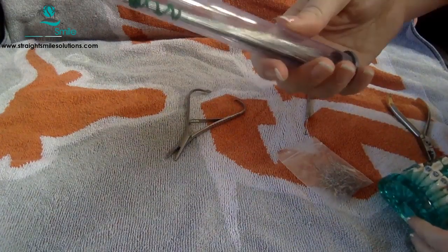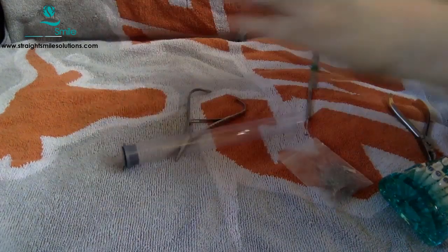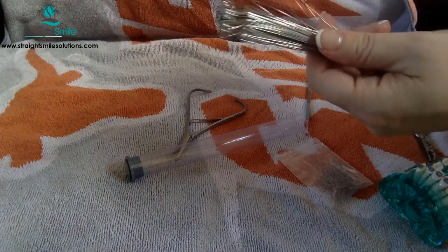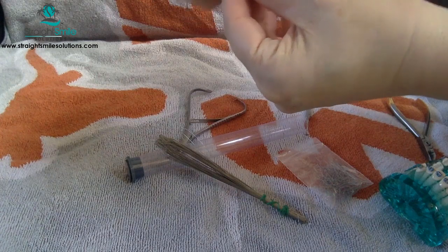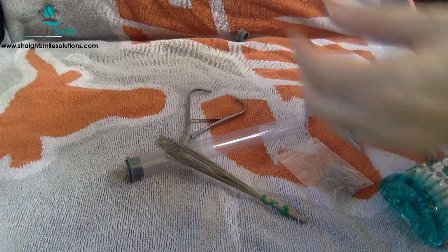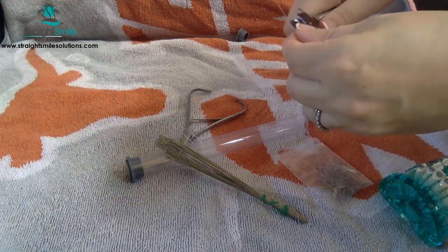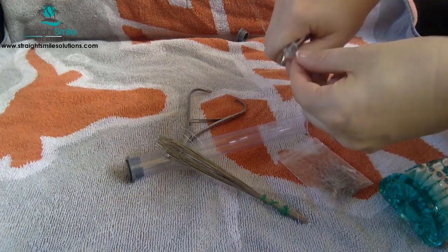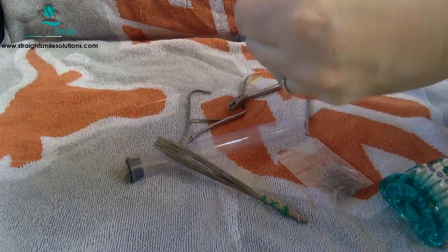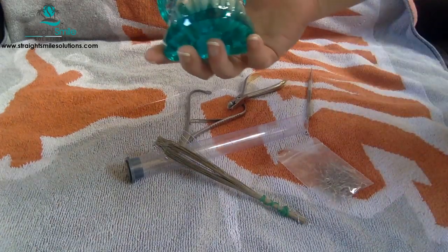The long ones work fundamentally the same way. You're just going to take one out. Just one. Sometimes it's great if you can package these separately so you're not grabbing them with your gloves. Grab it the same way as you did the other one. For me, these are kind of cumbersome just for a single tooth. I use these for other things like anchorage. But if I only have this, then I'm going to clip it maybe halfway down, so it's not so long and it's not flying into the patient's eyeball. I'll grab it, preform it, and do the same thing. So it still works. So that's how you stainless steel tie a tooth.